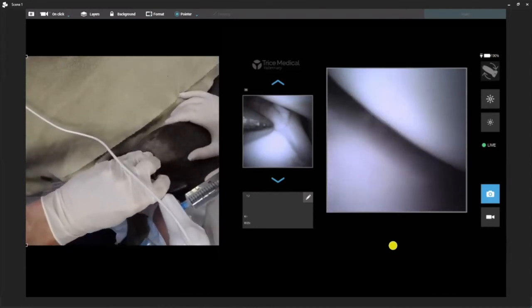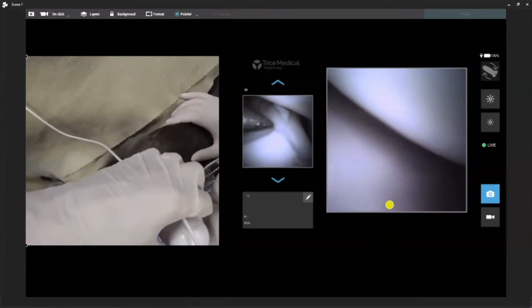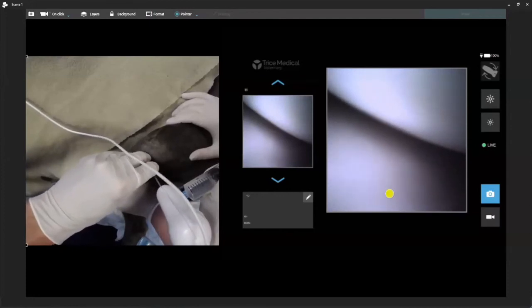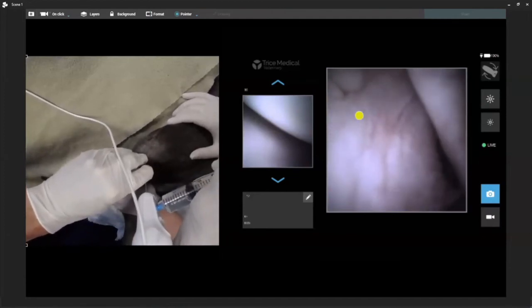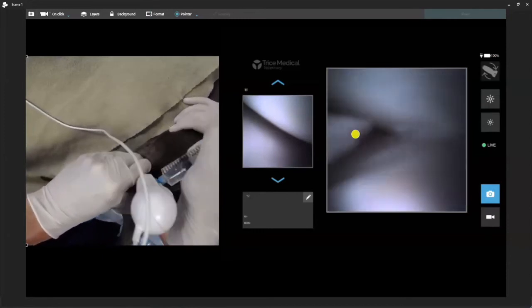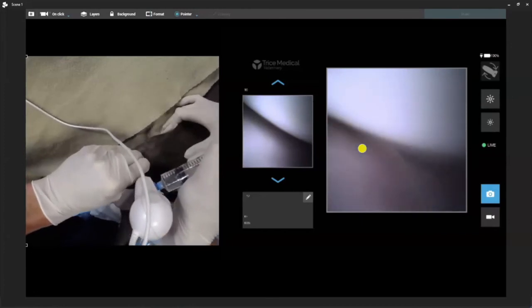Right away, the question is always — can I see past the fat pad with the needle scope? We went right past it. There is going to be our medial femoral condyle, there's our plateau. We're going to come along here — you can see all the way to the medial capsule. We're going to start to come back over. And we can go all the way up and under the region of our meniscus.